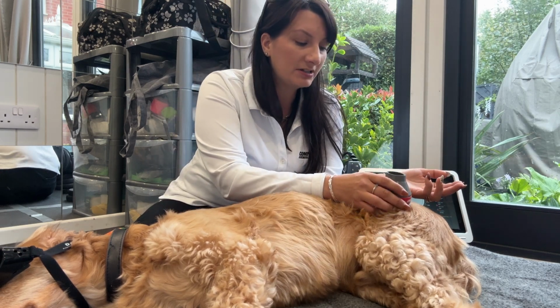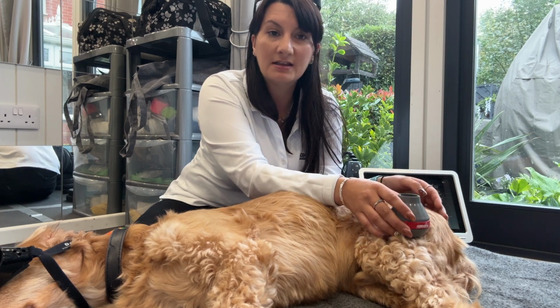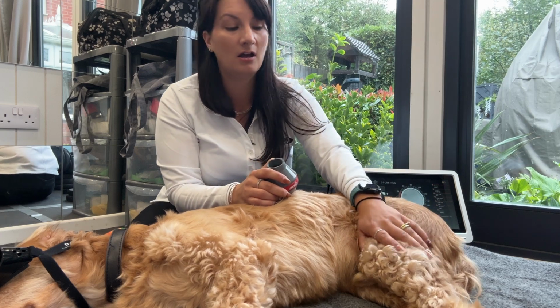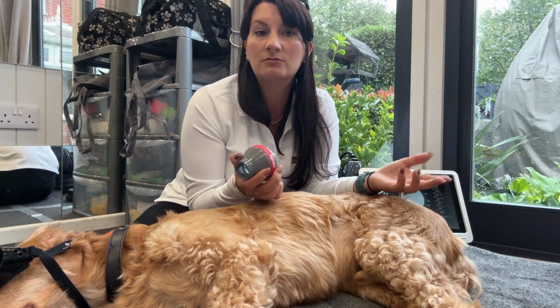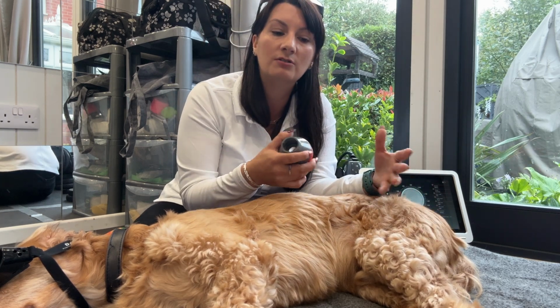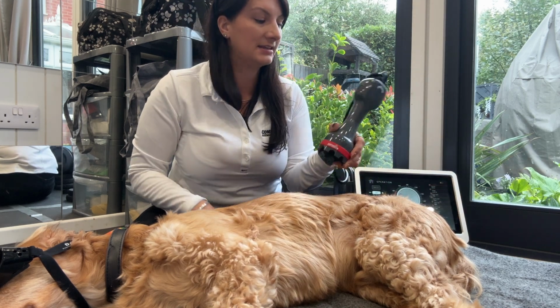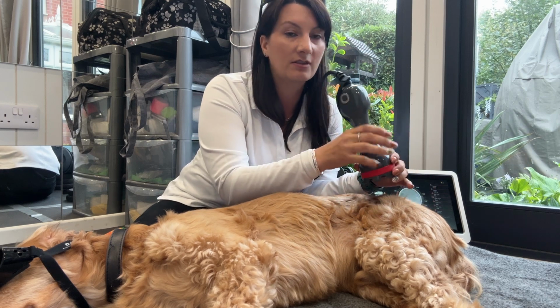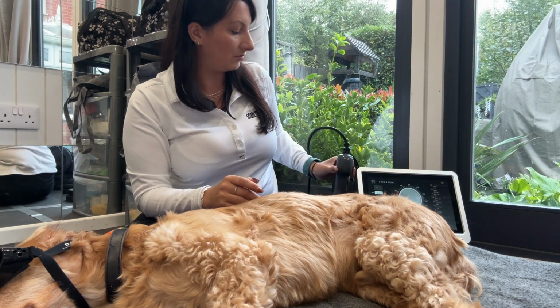So there are different methods of treating. Scanning, for me, is one of the most efficient ways of delivering a large dose, covering a large area. And that's why I like the IQ, because people will say, well, you're constantly moving, so how do you know you've dosed the tissue adequately? And with the IQ handpiece, it tells me, because it has an accelerometer in it, so that if I'm going too fast, it will alert me.